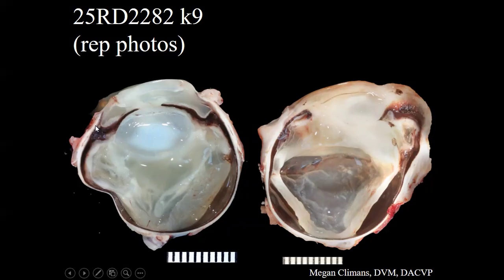And then the iris looks like it's wearing white eyeliner. It's got this kind of carpet over it, and also on the ciliary body surface, outlining the uveal tract, which I think you can see best on the left. You can still see that on the right as well.